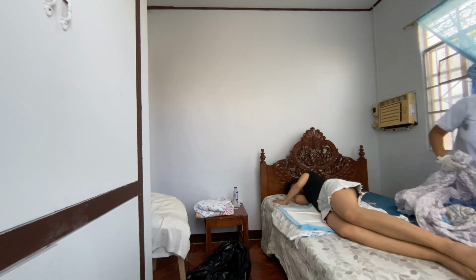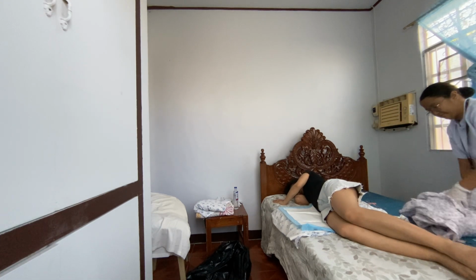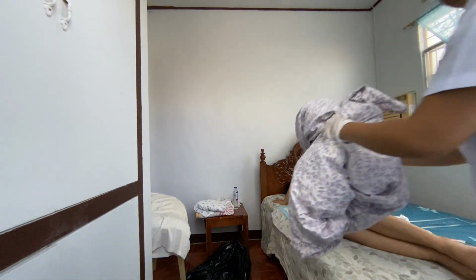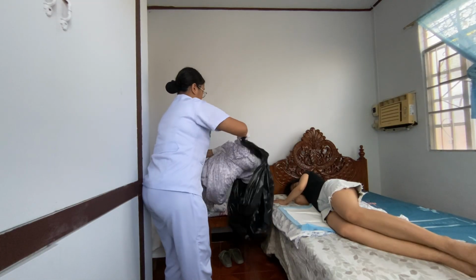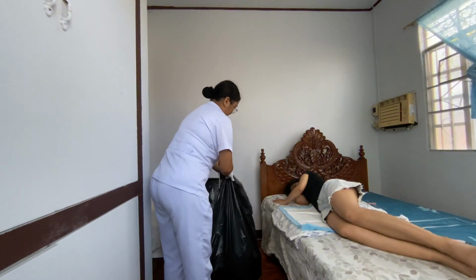Next, I'm going to loosen and remove all bottom linen. I'm going to discard soiled linen in a laundry bag or hamper. I did not place it on the floor or furniture, and I did not hold soiled linens against my uniform. This prevents the spread of organisms to another patient.